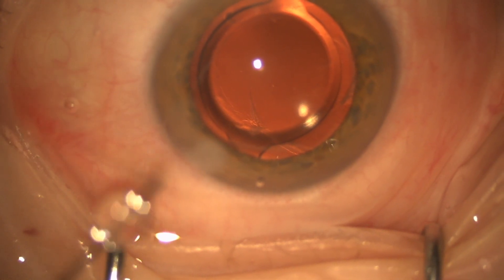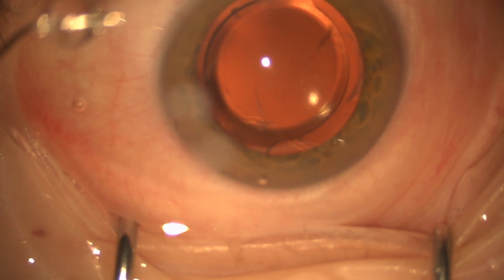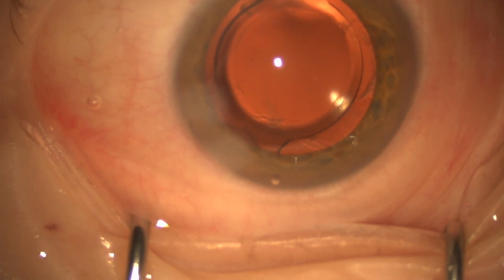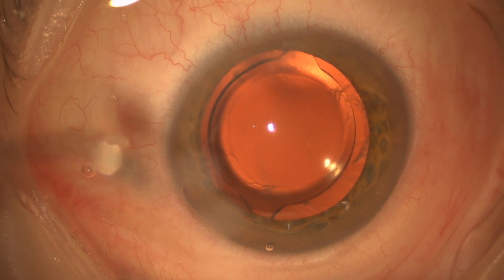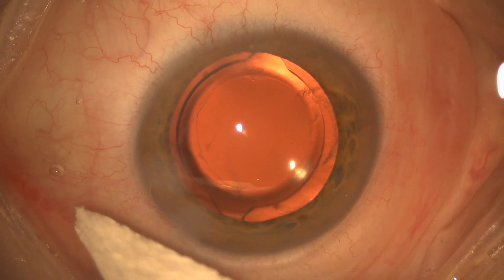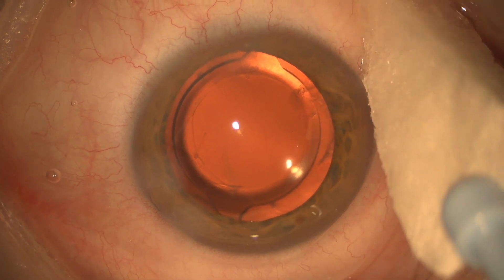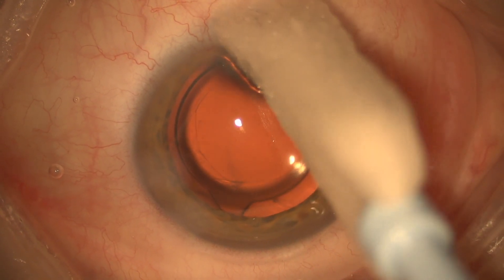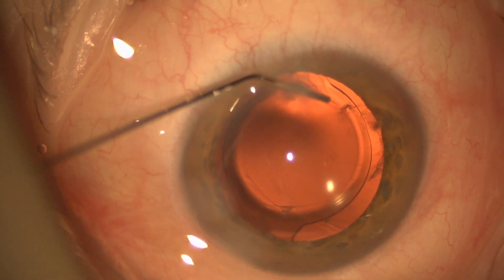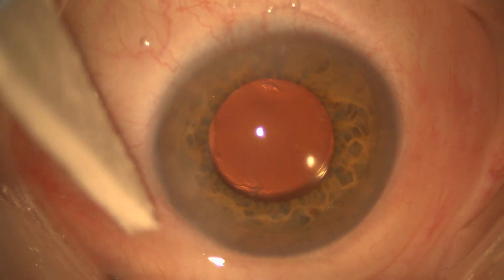So I'm going to go ahead and hydrate the wound here, and then we're going to start checking it with a Weck-Cel. Right now I'm just assessing how much vitreous I have and whether I need to do an anterior vitrectomy or not. There's obviously vitreous there nasally at the equator, but it's not really close to the center of the eye. I'm hydrating the wounds and repeatedly checking them with a Weck-Cel to see if there's any vitreous in the wounds — there's not. I can't see any other vitreous except for that strand there nasally, so I'm going to put in Miochol and bring the pupil down.